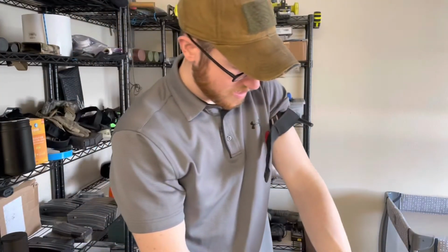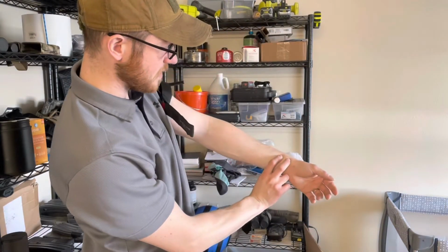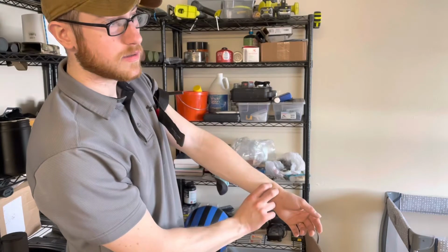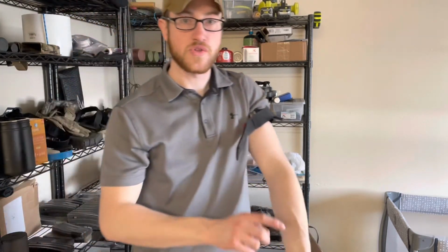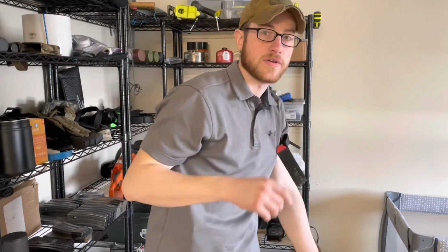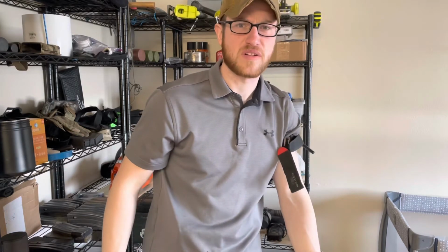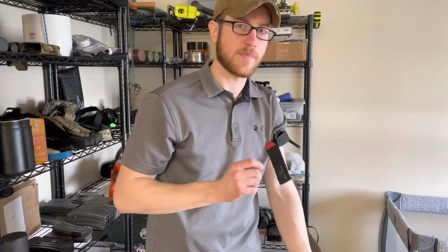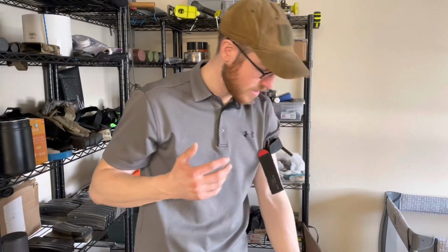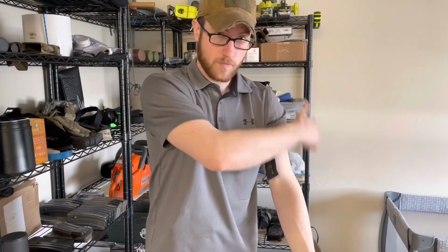Now, if you can feel a distal pulse, it's hard to pick your arm up, but if you can feel a pulse down here, you don't have an effective tourniquet. Now, it's important to note that you stop being able to feel your distal pulse, I think at like 60% or 70% occlusion. So just because you don't have a distal pulse does not necessarily mean that you have a perfectly effective tourniquet. So in real life, you stop winding the windlass when you fully control the bleeding.